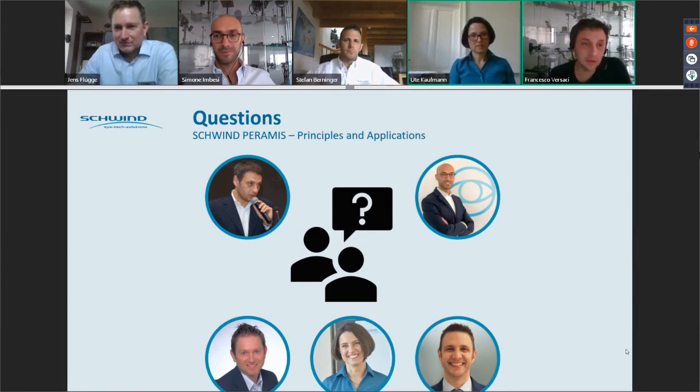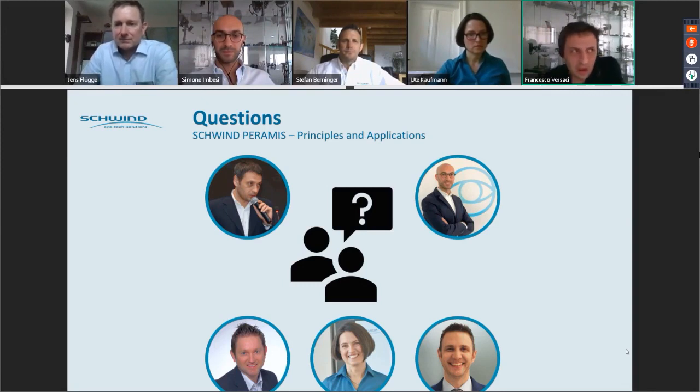What you have to take care of when you acquire keratoconus is that at least the pupil center is reliable, because as you can imagine, the keratoconus has no straight fixation, so we cannot be sure that the patient is fixating at the same point. So it's a good idea to check the repeatability of the pupil position in the quality summary map. This is a tip that I would like to give the user.